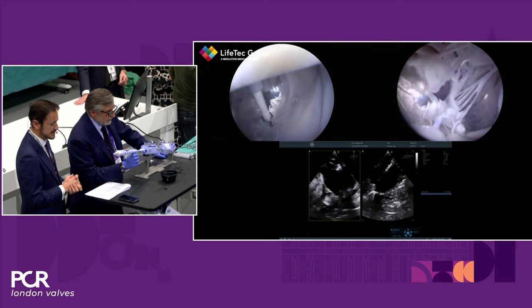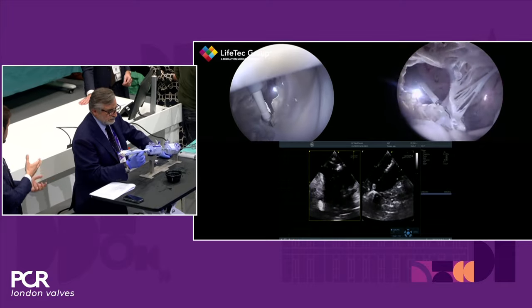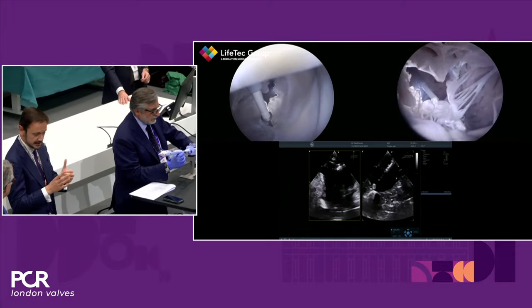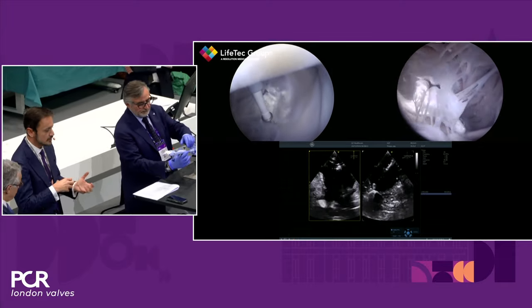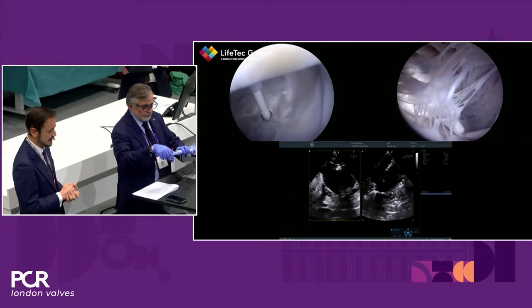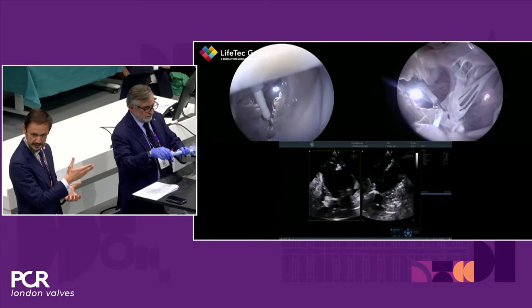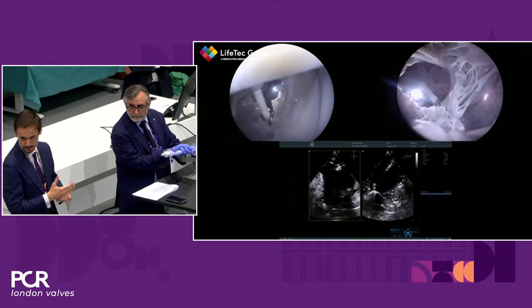Obviously, what is missing here is the evaluation of the leaflet insertion. In reality, we would check carefully in echo if we have enough leaflet inside. Otherwise, we would eventually optimize leaflet insertion. But if the leaflet insertion is okay, and there is no residual jet between the clip and the commissure, we would probably deploy this clip and eventually put a second one.